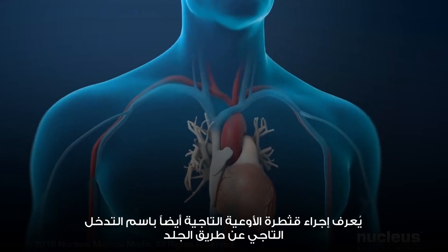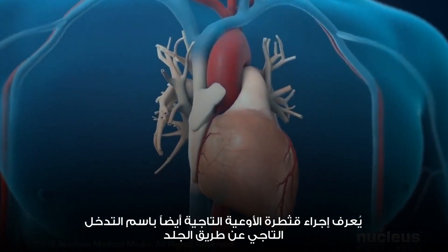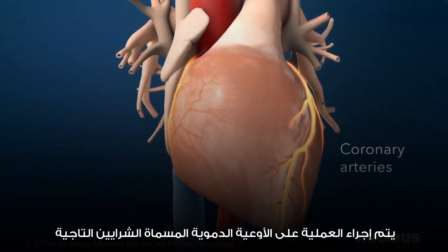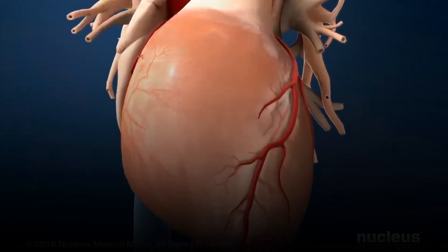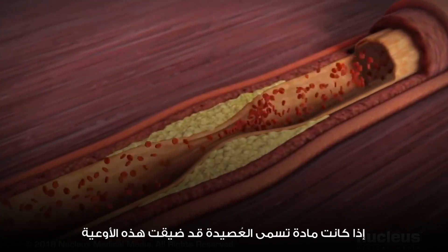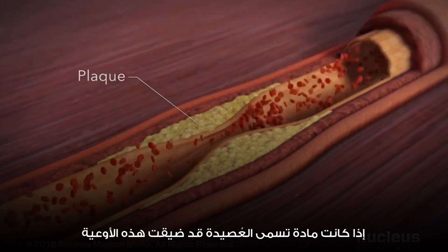A coronary angioplasty procedure is also known as percutaneous coronary intervention. The procedure is done on blood vessels called coronary arteries, which supply your heart muscle with oxygen. The goal is to restore blood flow if a substance called plaque has significantly narrowed these vessels.